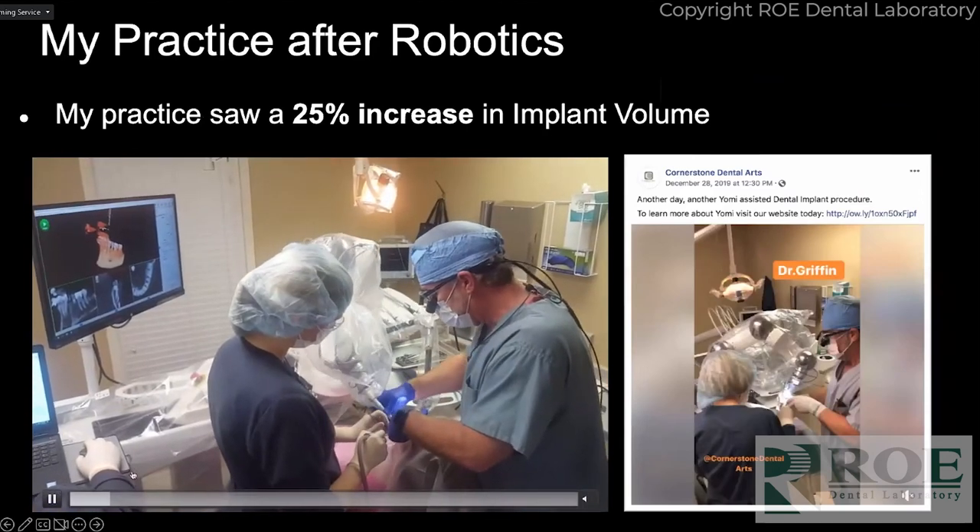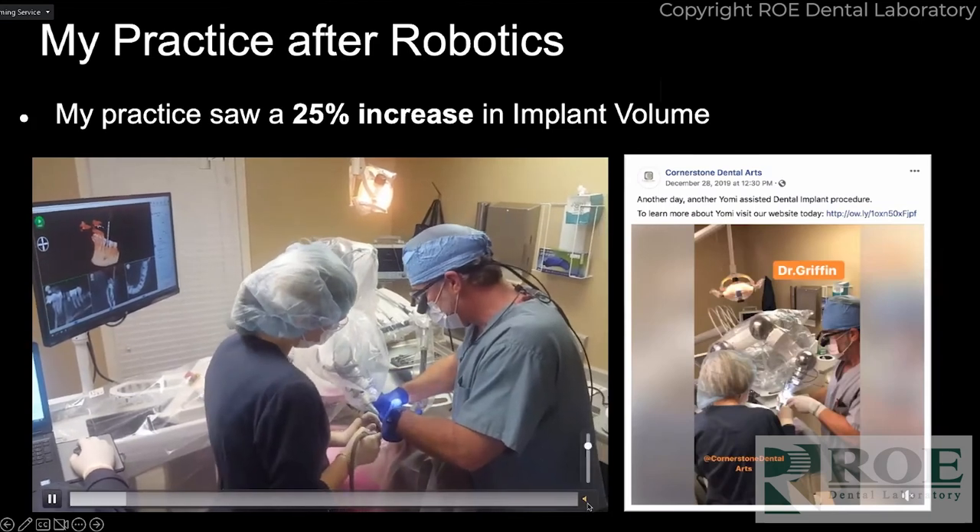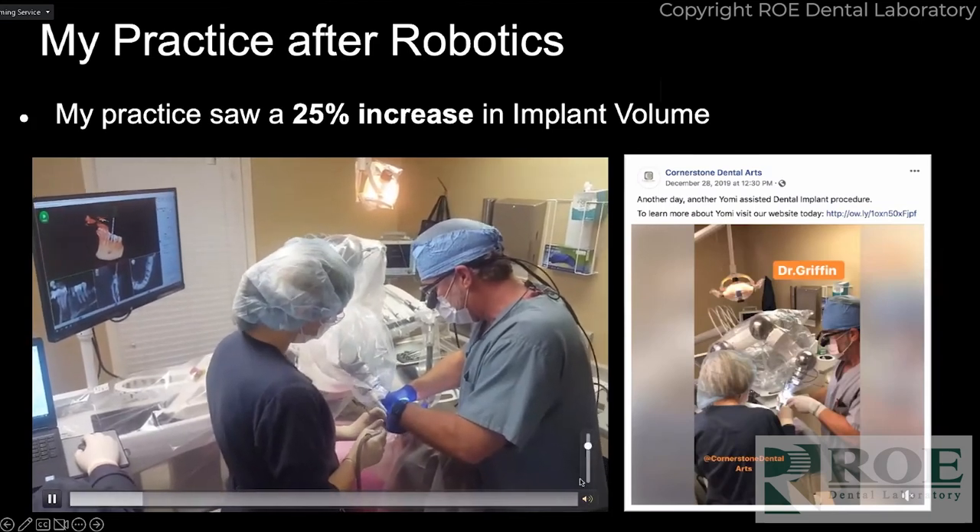Afterwards I saw about a 25 percent increase — this was one of the first or second machines we put in.